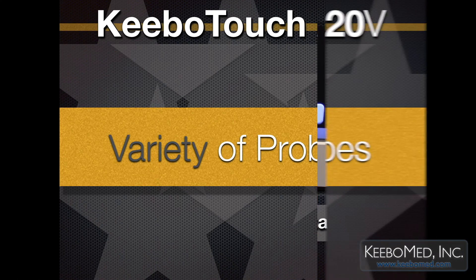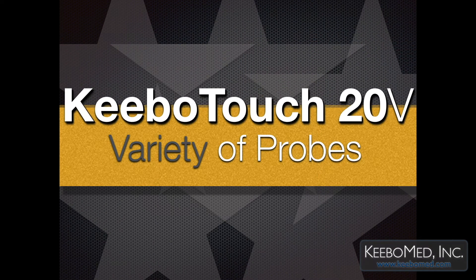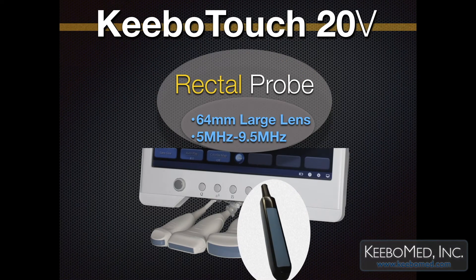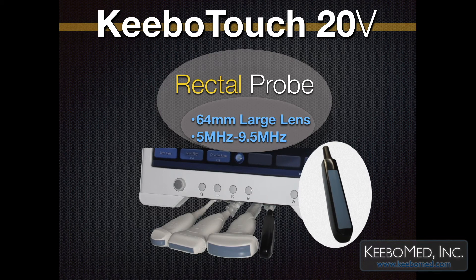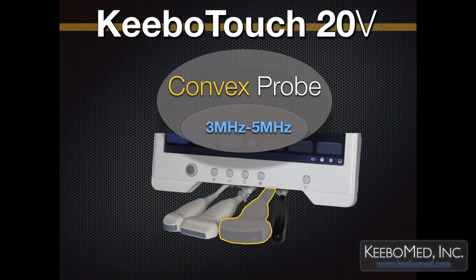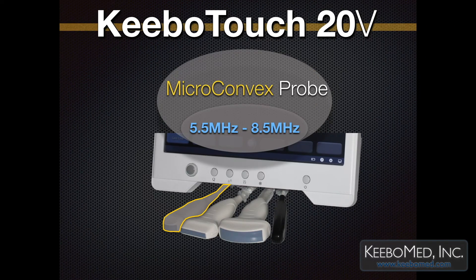Kibo Touch 20V is affordable, and as standard it includes one probe of your choice. There are a variety of probes to choose from, and each probe comes with THI function as standard. The Rectal Linear Probe has a large 64mm lens with a frequency of 5–9.5 MHz. The Linear Probe is 5–11 MHz. The Convex Probe is 3–5 MHz. The Micro Convex Probe is 5.5–8.5 MHz.